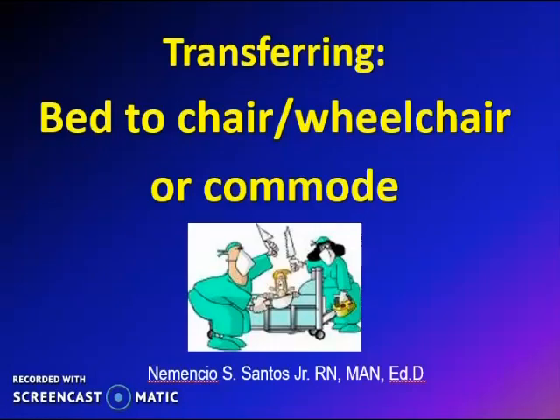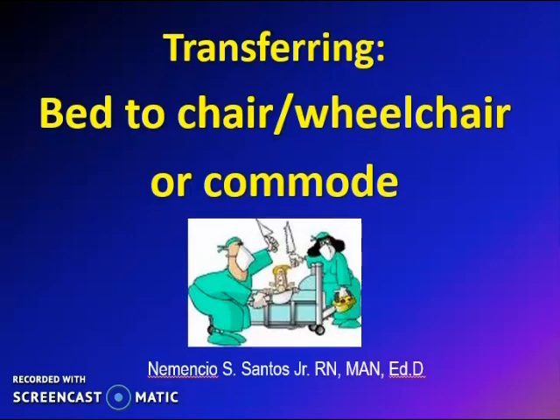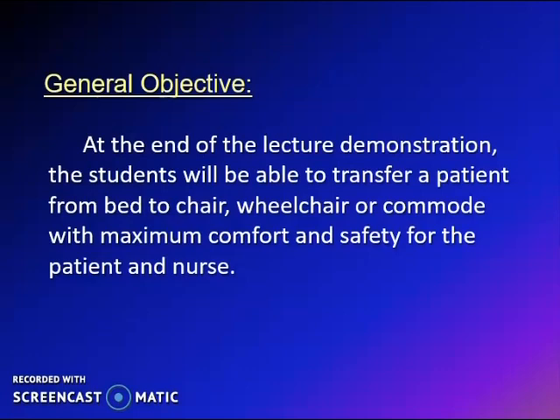Good day. This is Dr. Nemi Santos, and let us now discuss the procedure on how to transfer a client from bed to chair, wheelchair, or a commode. At the end of the lecture demonstration, the students will be able to transfer a patient from bed to chair, wheelchair, or commode with maximum comfort and safety for both the patient and the nurse.